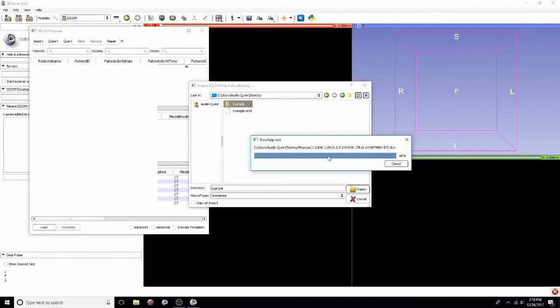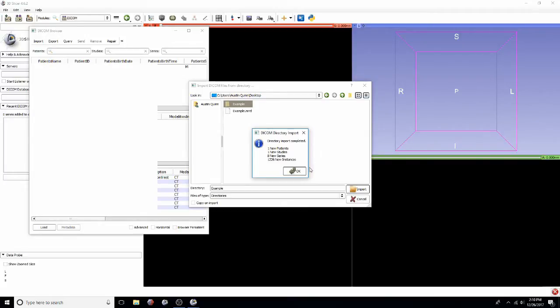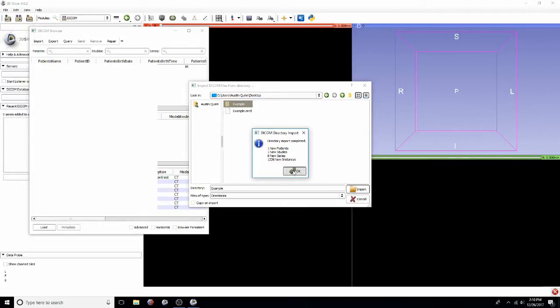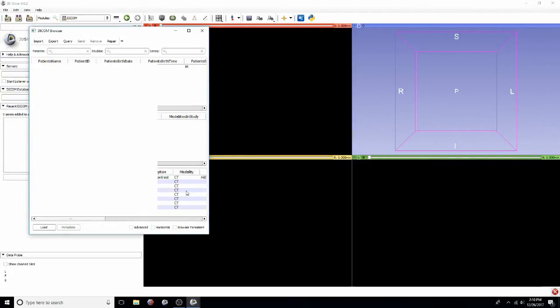Once you get that file imported you'll select your series of interest. In this tutorial we'll be segmenting out a hip and femur, just the bony structures.